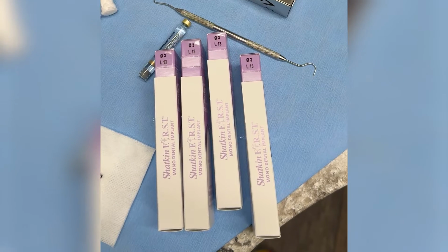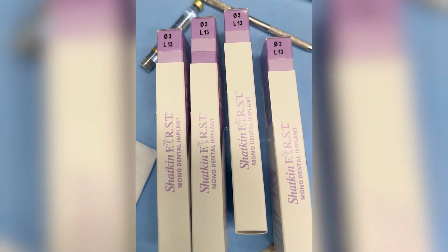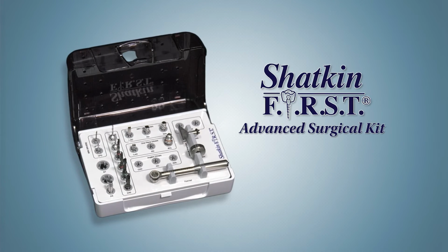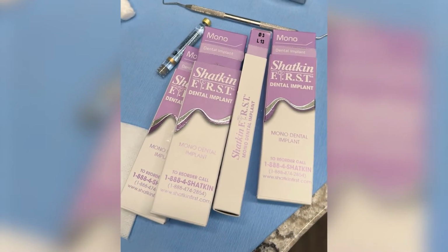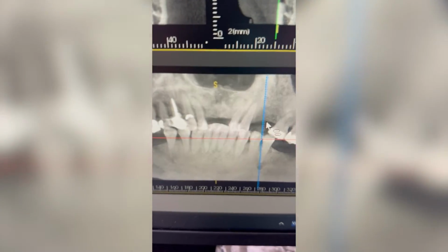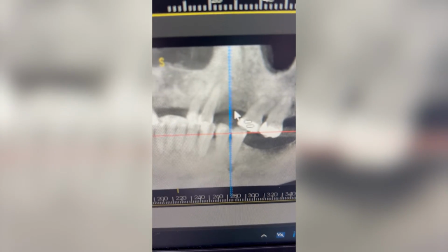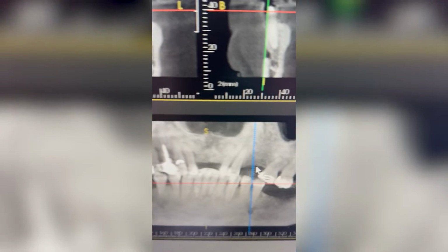Hi, I'm Dr. Todd Shatkin, and we're about to place 4 3013 mono implants. This is the mono kit, and we're going to be replacing number 8 and 9 and number 12 and 13 with mono implants. And here's the x-ray of the areas that we're going to be replacing the implants. 8, 9, 12, and 13.